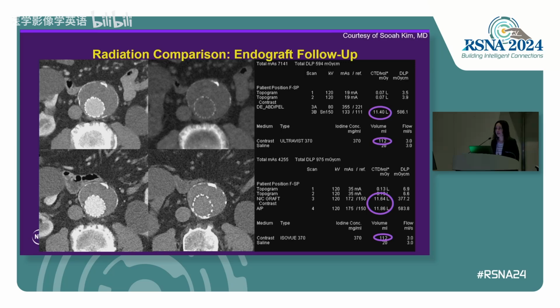So as I said, you can build these virtual non-contrast images into your protocols. And here's an example where the patient had an exam on our dual energy scanner on the top. So this is a virtual non-contrast, whereas they also had this CT angiogram on the bottom on a conventional CT scanner. So this is a true non-contrast. Diagnostically, I think pretty similar. I feel equally as confident on both. And you could see, maybe you can't, but we gave the same intravenous contrast volume on both of these scans. Sorry, you couldn't see my mouse. The top is the virtual non-contrast.